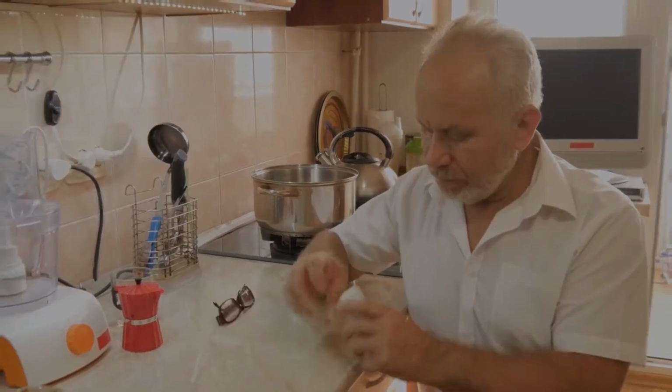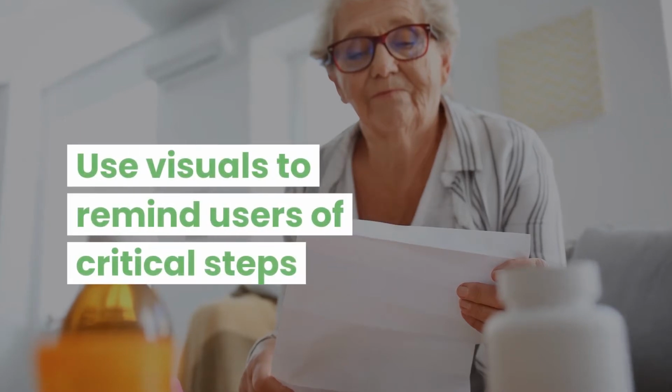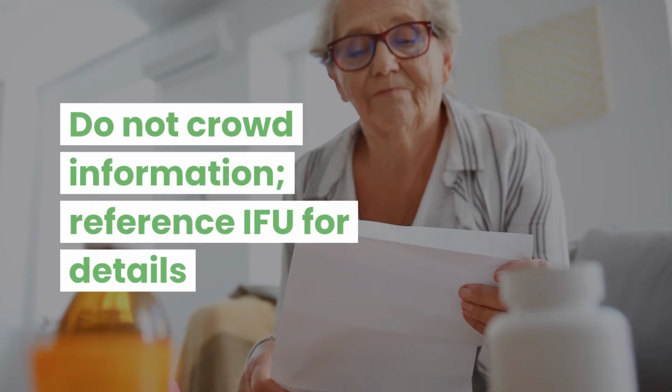A quick reference guide is helpful for many users, but should not replace instructions for use. Use visuals to remind users of critical steps, and do not overcrowd information on the quick reference guide. Reference the IFU for details.